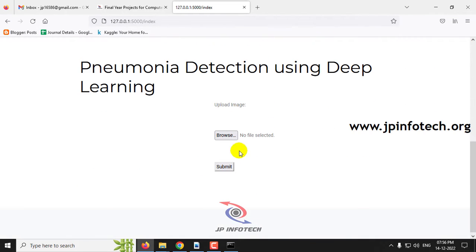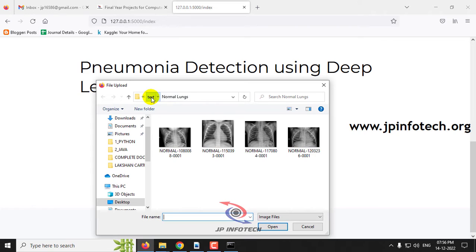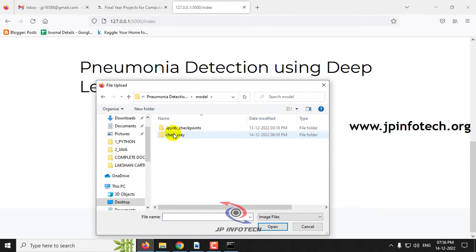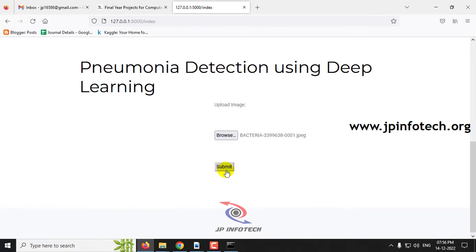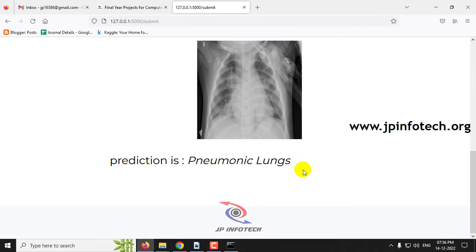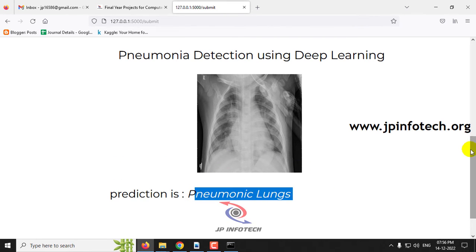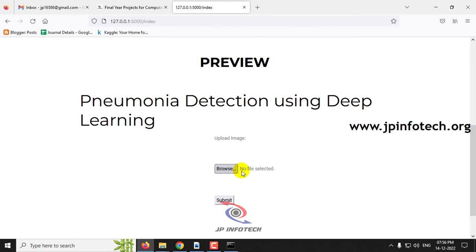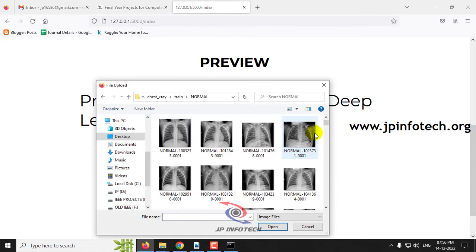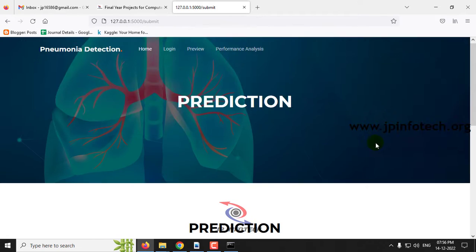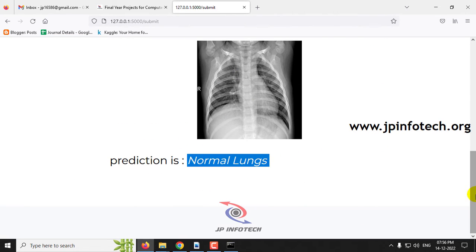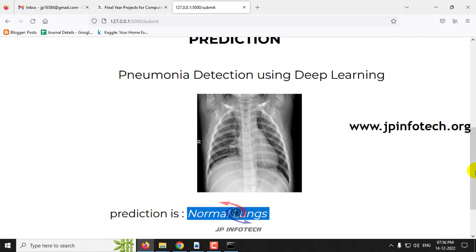Let me click the Preview menu again to test with additional cases. This time I am going to the training dataset rather than the test folder. In the training dataset, there are around 3,000 images. Selecting a random pneumonia image and clicking Submit shows the prediction result as 'Pneumonia Lungs'. Similarly, selecting a random normal image from the training data and clicking Submit shows the prediction result as 'Normal Lungs'. In this way you can check other cases from the dataset or the test folder.